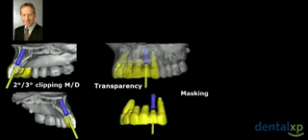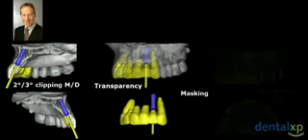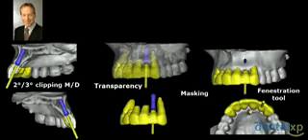So we can use different tools, and you know the real tough part about learning the software, it's crazy. You got all these buttons to push, but the reality is the software should be learned in reverse. The question is, what information do you need to make a better decision? And then you learn where that particular component of the software is, such as this transparency tool, which Scott alluded to as well. Ultimately leading to a pretty precise development of where the emergence is going to be.